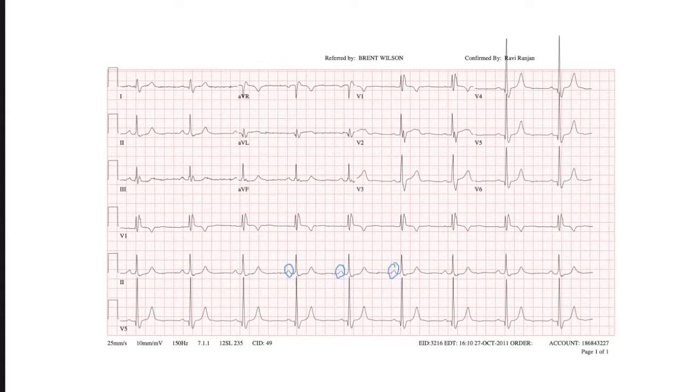Derek, do QRSs. And then Tanner, will you do T wave? Okay, Ben, do you think this rhythm is normal? Yeah, order-wise is normal.